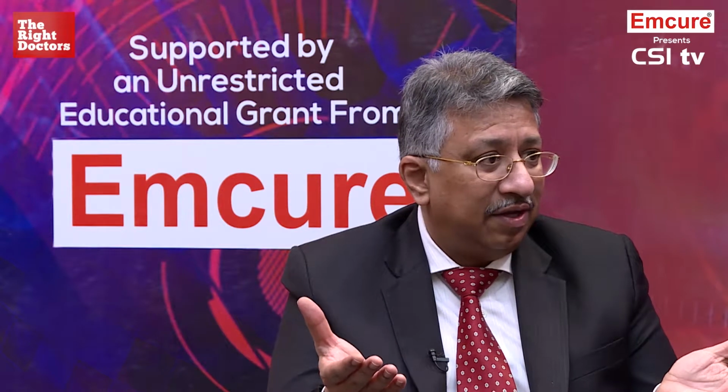We have a second set of figures to tell us, a 5, 6, 7, 8 rule. In other words, if you do a left main stenting, you must at least try and attain an 8 millimeter square area in the left main post stenting. At least, that's the word. But again, there is data to show that if it is less than 8, you get greater events. But again here, this is not an Indian population. We do not have data in the Indian population, to put it frankly.